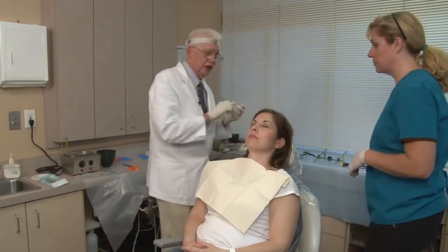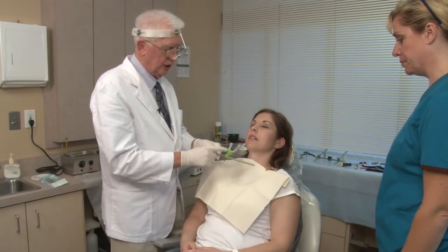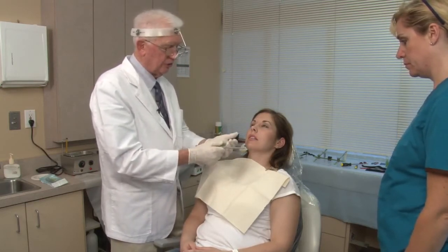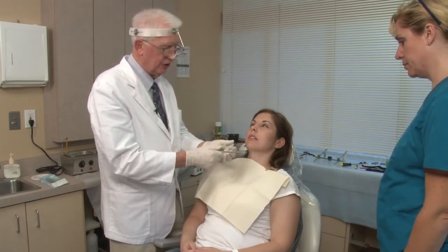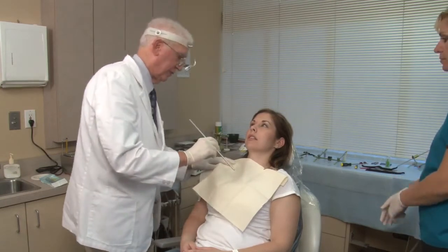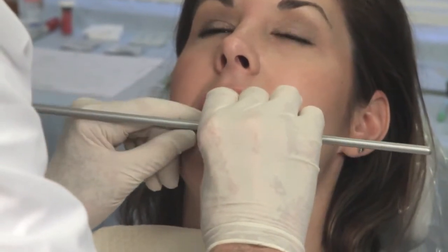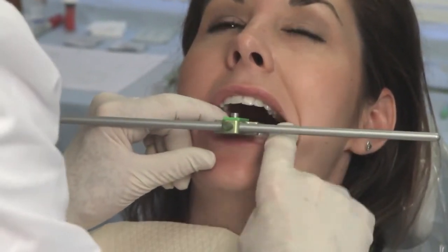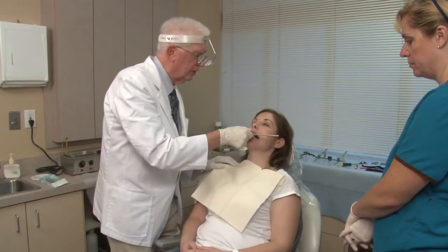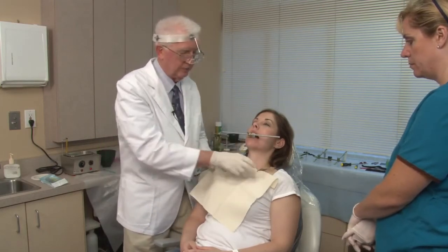Now I'm going to try the clutch in. I have the clutch set up with the crossbar, and I have one thickness of discluder. First I have to check the fit and the retention of the clutch. The clutch must fit very tight. Let me know if anything feels uncomfortable, sharp, or anything like that. Okay, close a little bit, stop, open a little bit. Fits good, nice and firm.